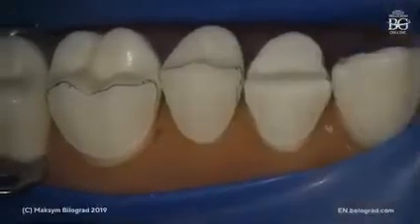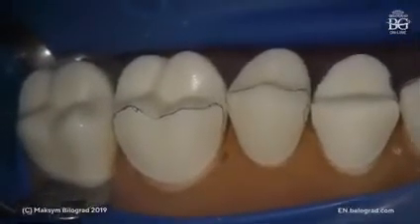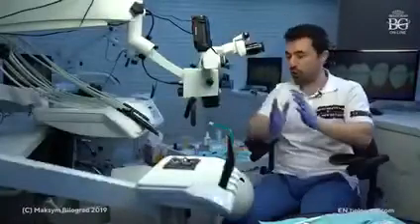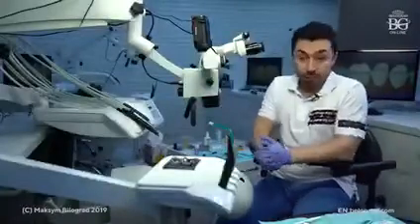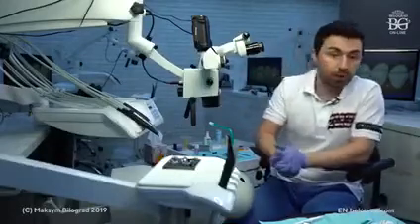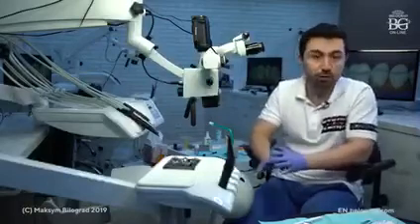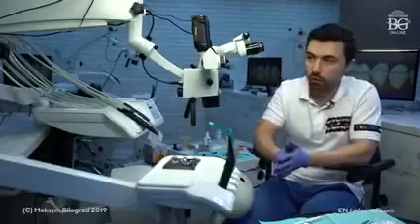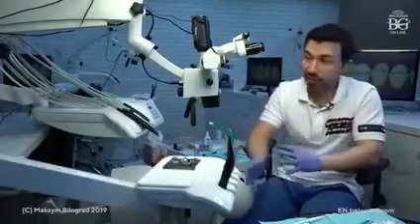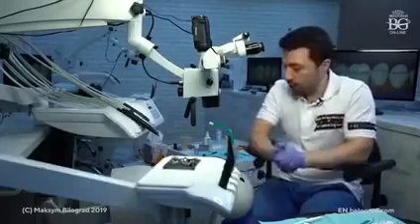Okay. I think it's pretty visible and also pretty understandable. I hope so. So, during this online masterclass, I showed you 3 different types of veneer preparations for molar and premolar. You can combine these different types of preparation for many clinical cases. You can do window prep on premolar, you can do occlusal reduction and veneer overlay on molar teeth. It's just about the certain clinical situation, okay?